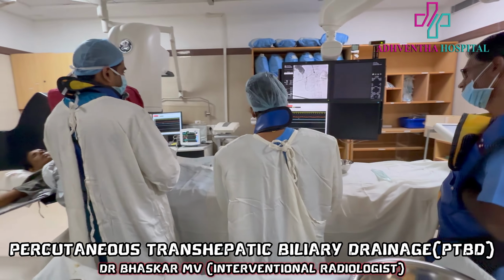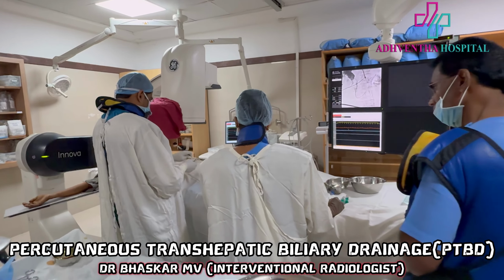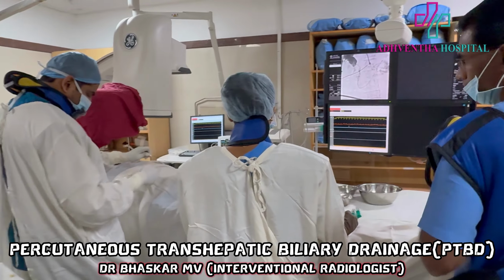Serial dilatation of the tract has to be done. Then place the long multi-hole catheter inside. Can you show?